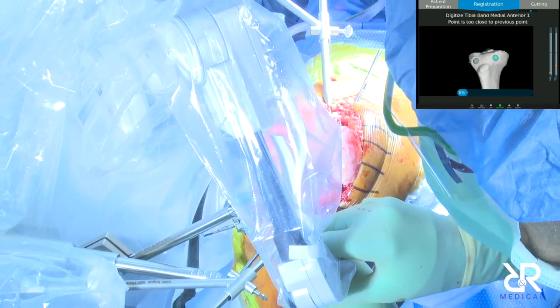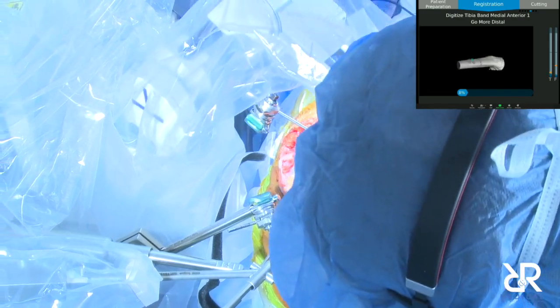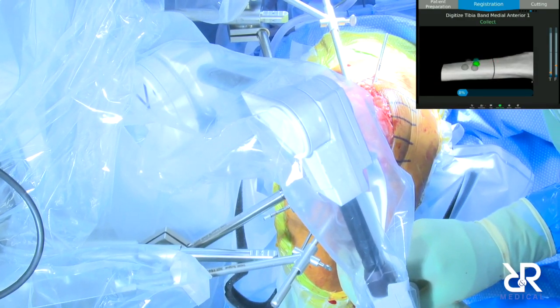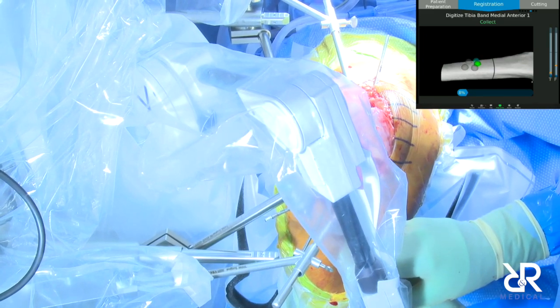On the soft bone, you have to be really careful you don't poke through the soft bone, right? Because then you get an inaccurate registration.